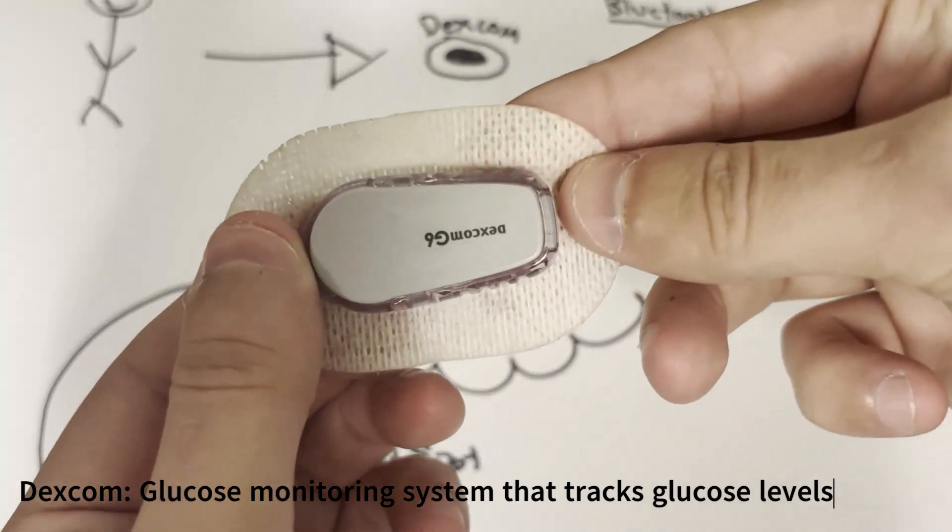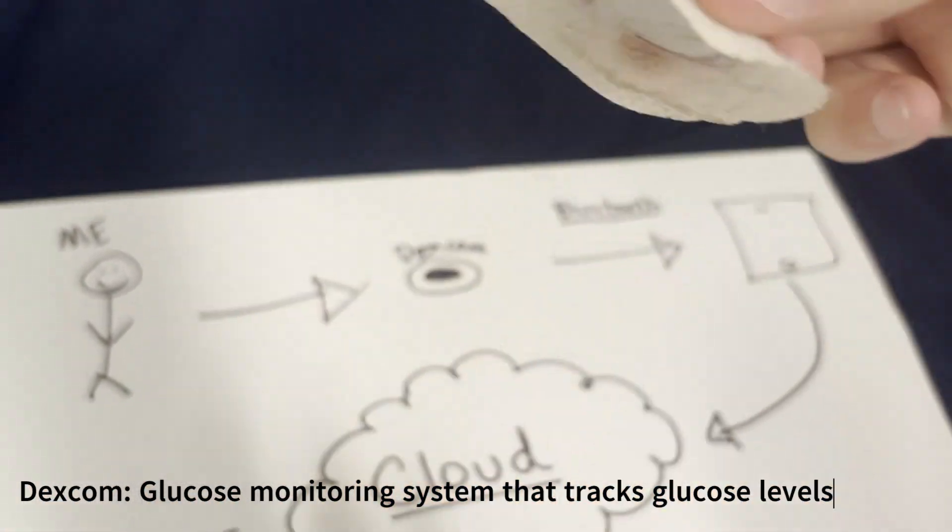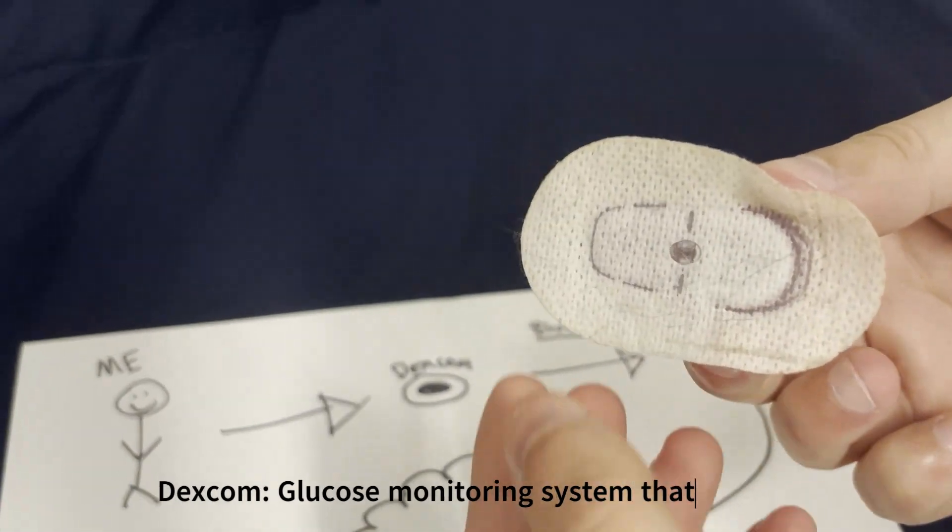This gray piece is going to be the transmitter and this clear piece with this pad, which is sticky — that's what's connected to my body. That's called the sensor.